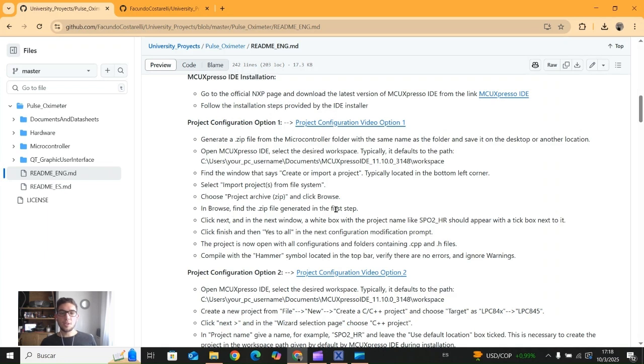Hi, in this video we're going to see one way to configure any project in our MCUXpresso IDE. This is the easiest way to do this.